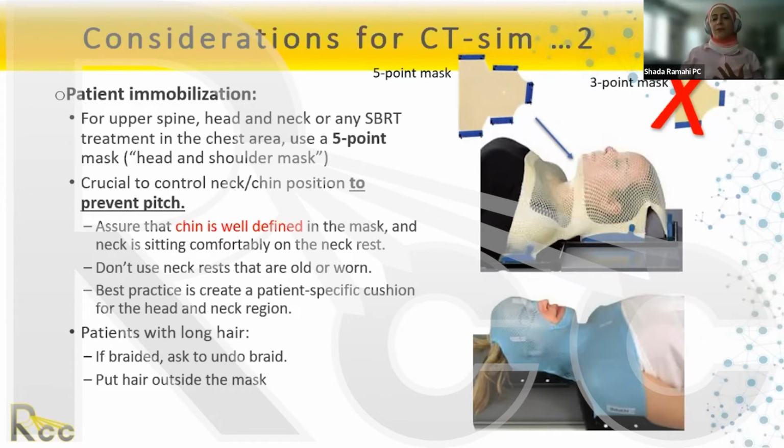And another thing that we did is that we brought in one of the vendors from where we buy our masks to give another training. So we try to have a training for the CT Sim therapists, a sort of continuing education type training, every 3 to 4 months. And we told them that recently we've been seeing that the masks are not well matched, and there's a lot of 2 to 3 degree rotation pitch on the neck.